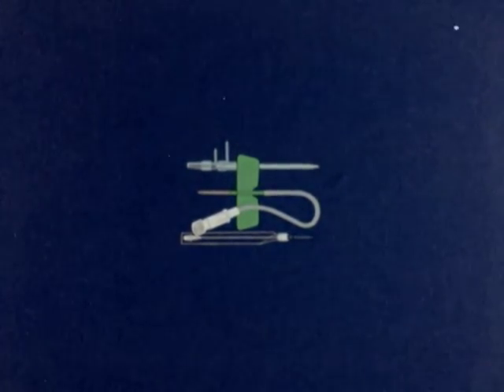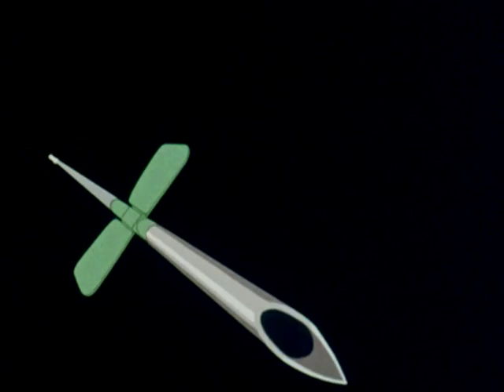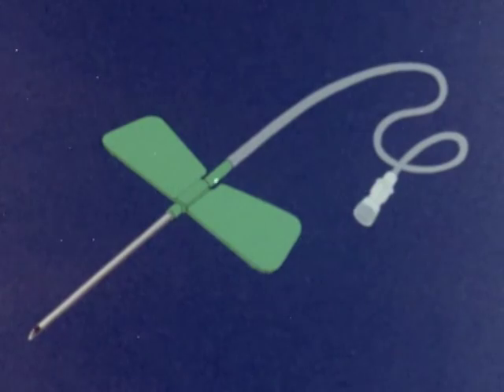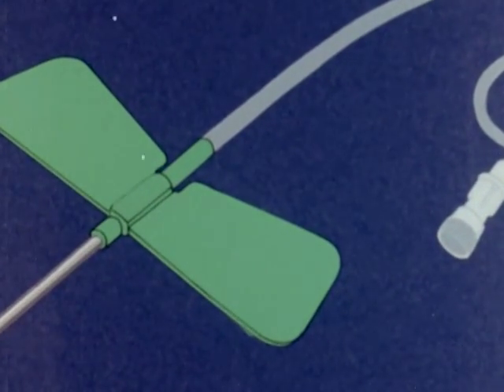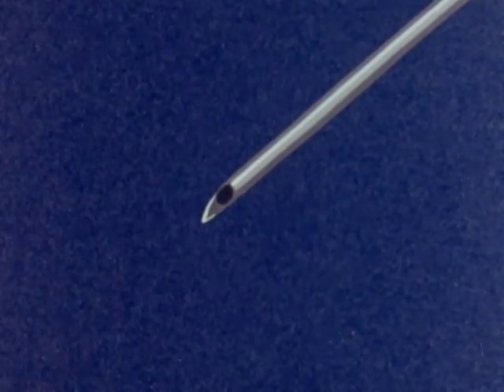The butterfly needle has gained widespread acceptance because of its ease and simplicity in use. Originally developed for use in babies' scalp veins, it proved so successful that its use spread to other difficult procedures: the elderly, the obese, and the vasoconstricted patients. Clearly, the advantages of butterfly sets in these difficult procedures made equally good sense in routine venipuncture. So the larger sizes were developed to provide the flow rates necessary for routine adult infusions.